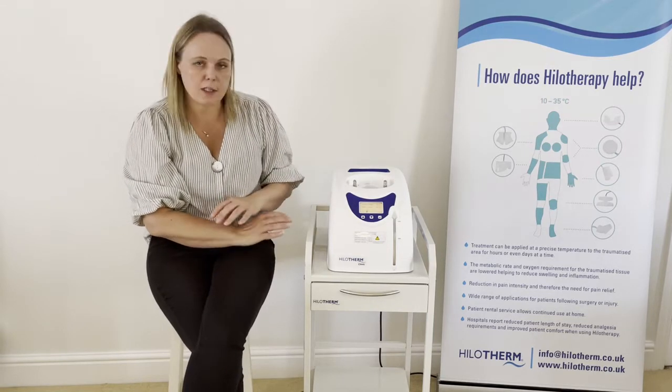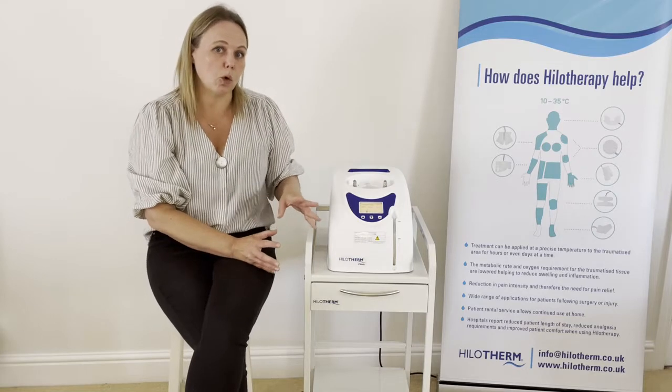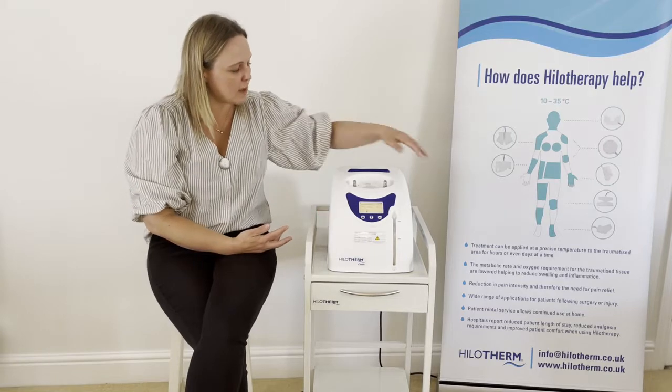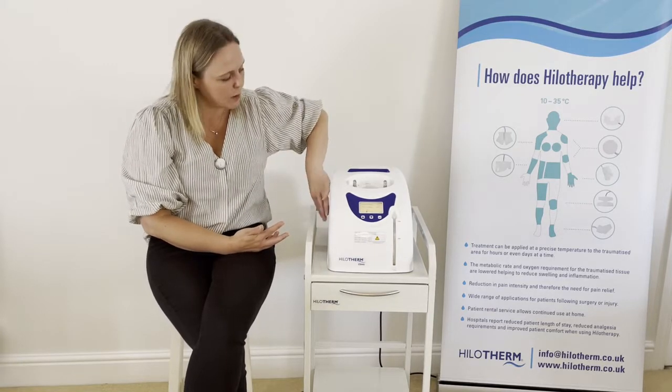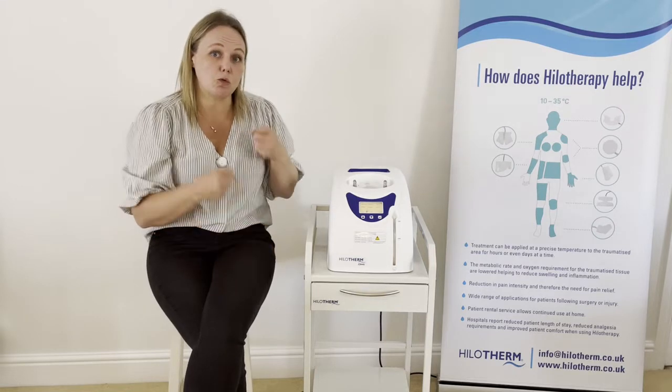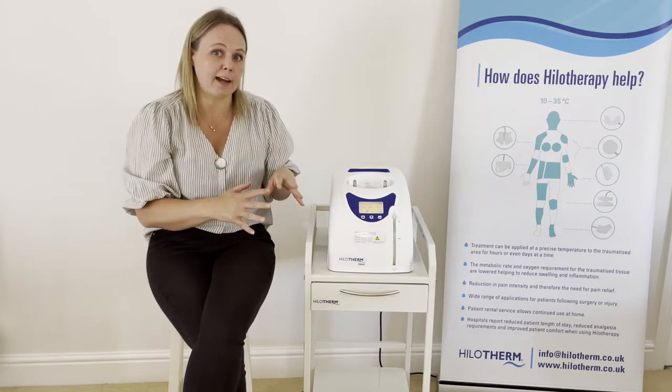If the temperature just isn't reducing down at all, or it has been at a temperature and then suddenly it's not, the first thing you need to check is the blue panels on the side. The device needs to draw air in and push air out in order to cool effectively.